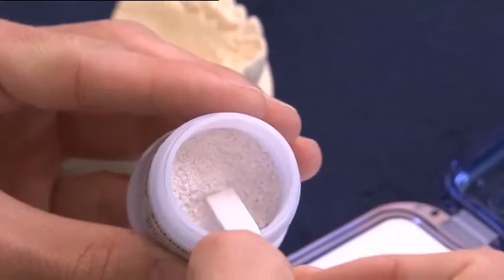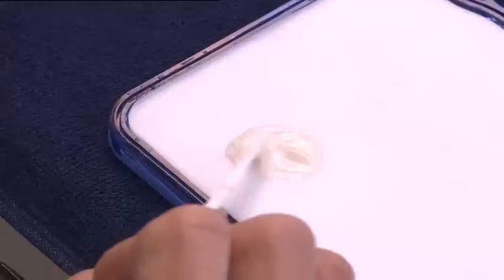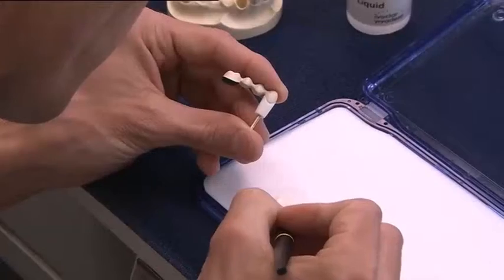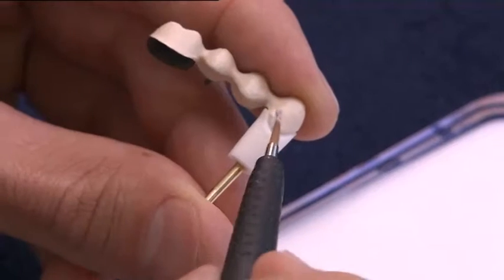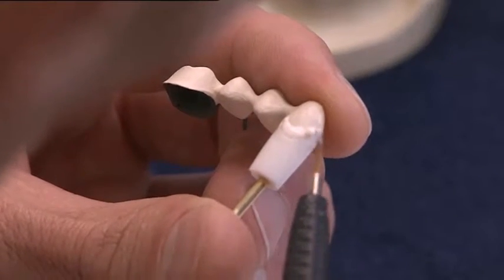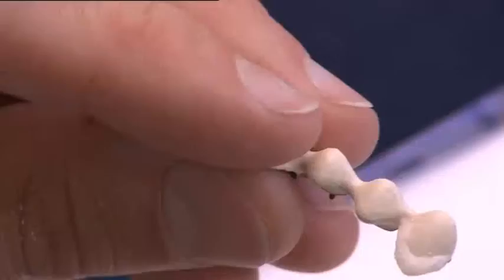Mix the margin material with the margin buildup liquid on the mixing plate until a creamy consistency is achieved. Four additional intensive materials are available for fabricating highly aesthetic restorations. Apply small drops of margin material in the cervical area and dry. Carefully remove the framework with the dried margin material from the die and fire.